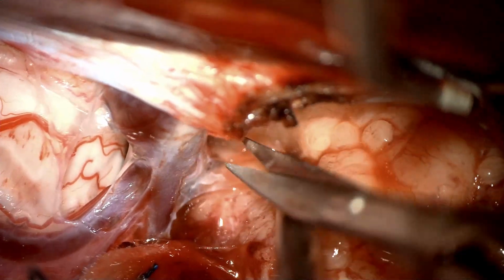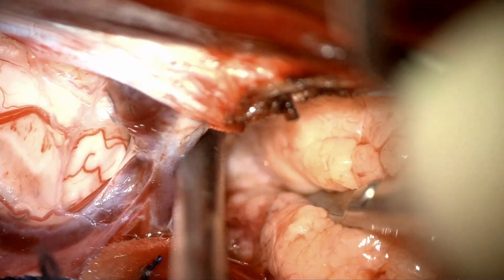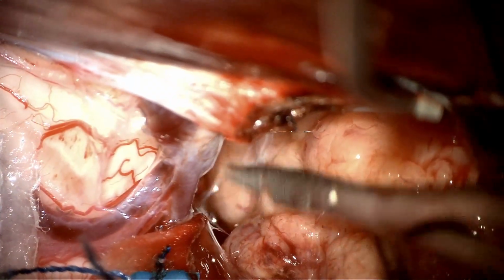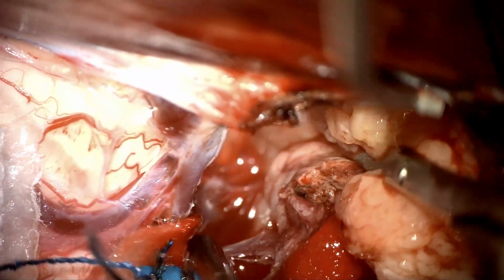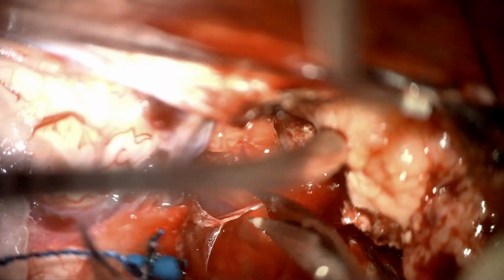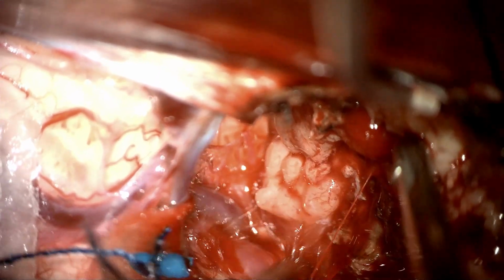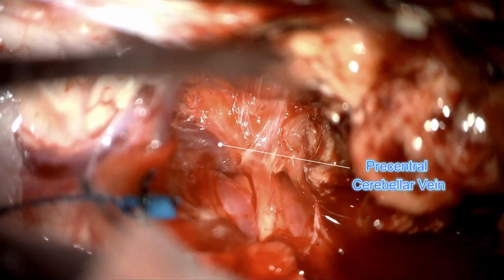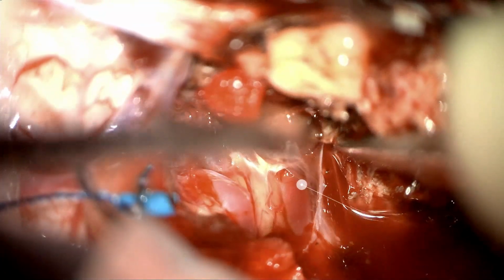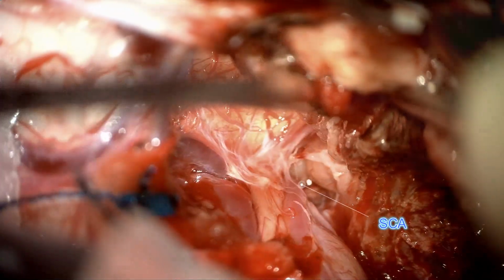I personally like to use these bayonet scissors curved up when I'm dealing with deep venous structures, as I can use them as a retractor with the belly of the scissors. I can also use the tip of the scissors for dissection or as a hook, and I can also use it for sharp dissection. You see how this clean dissection allows us to even see the pre-vermian vein that has been preserved and the superior cerebellar artery that now comes into view from the contralateral side.